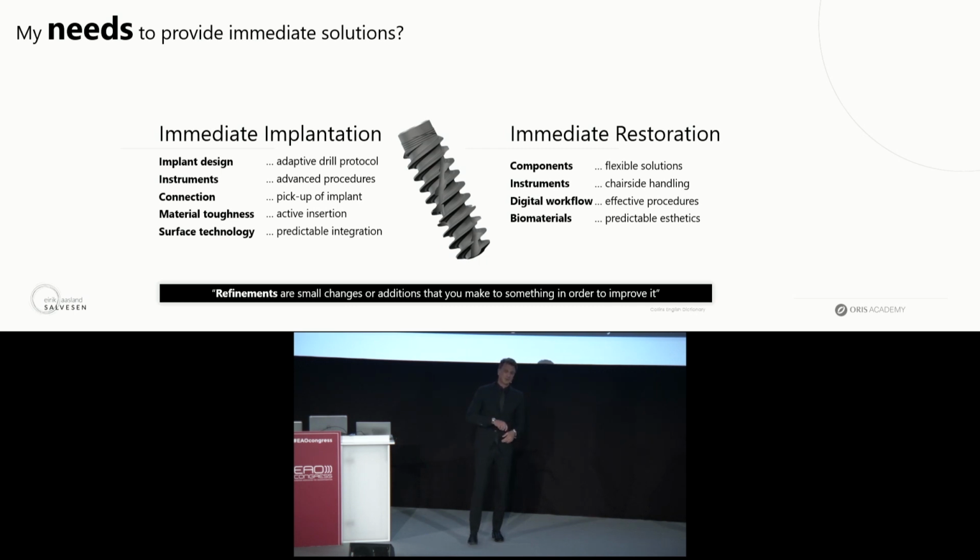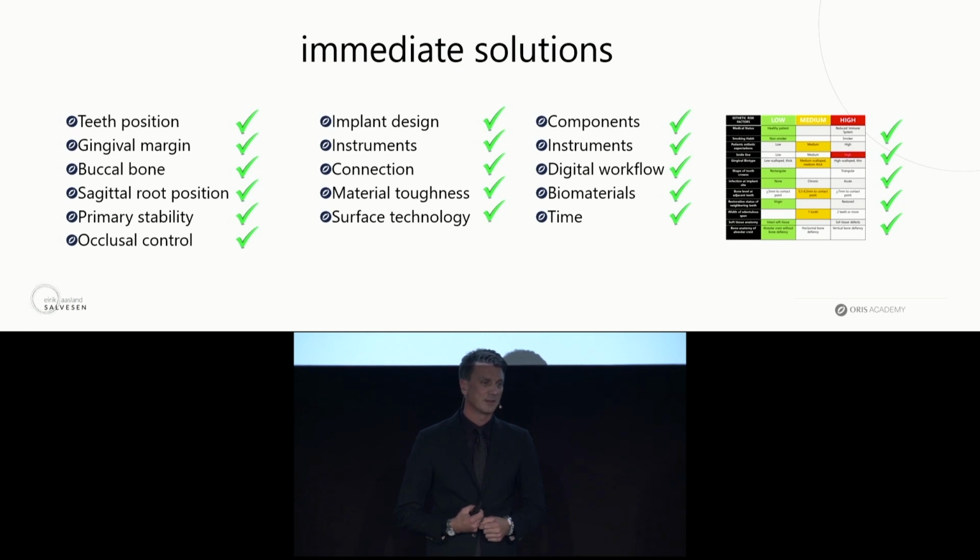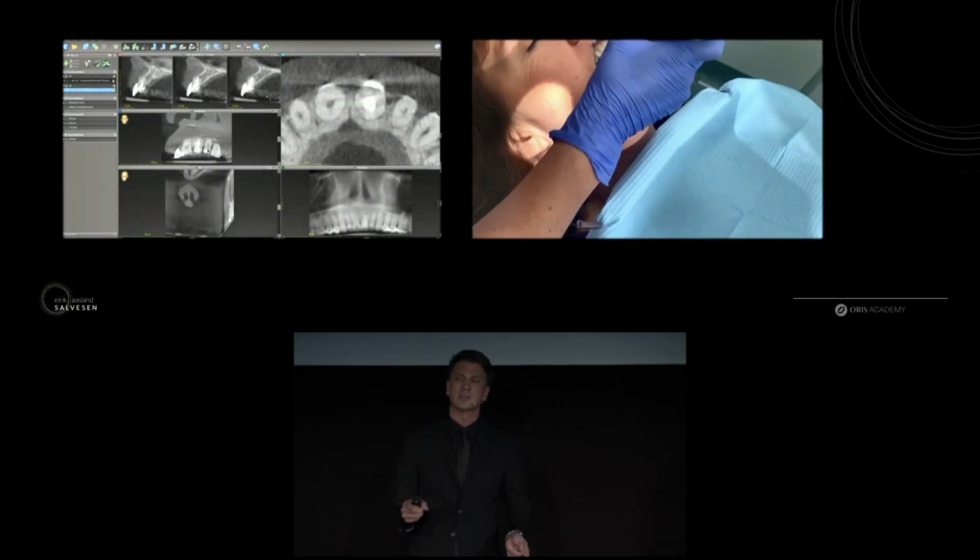And in my experience, placing an implant surgically in an extraction socket takes me about this time. Doing the restorative temporization of the patient takes this time. So basically, it's the time to do it on the prosthetic phase, and you need to plan for that in your schedule, in your logistics. So I tick off, on my colleague, basically all boxes green. It's a good case. So case-selection-wise, I'm happy and lucky with my colleague. Everything's green. So let's see how we apply this information into going digital.